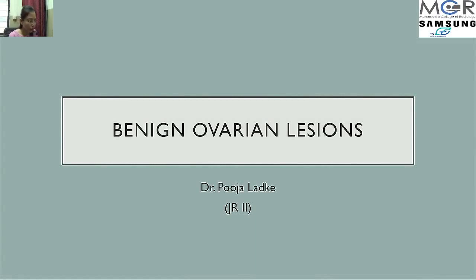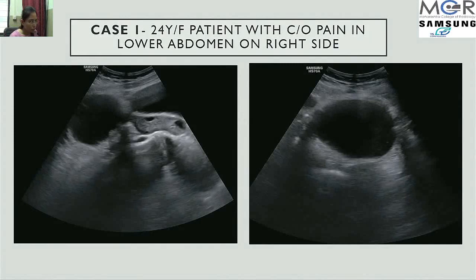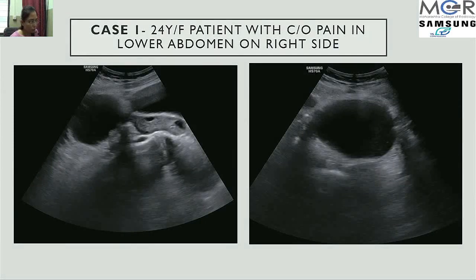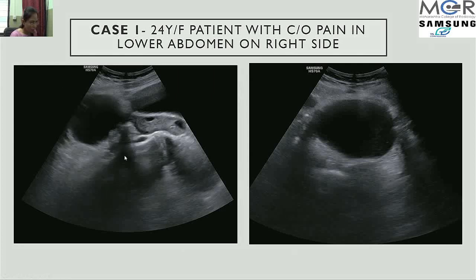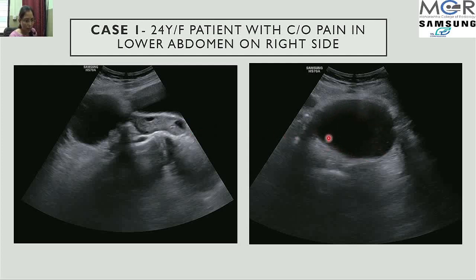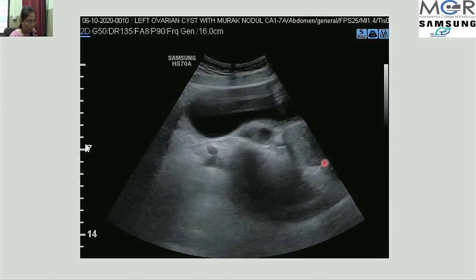Now showing a few cases of benign ovarian lesions. Case 1: a 24-year-old female came with pain in the lower abdomen on the right side. A well-defined anechoic cystic lesion less than 10 centimeters in size was seen arising from the right ovary. A few follicles were present in the right ovary. The same lesion measuring less than 10 centimeters was confirmed as anechoic on color scan.